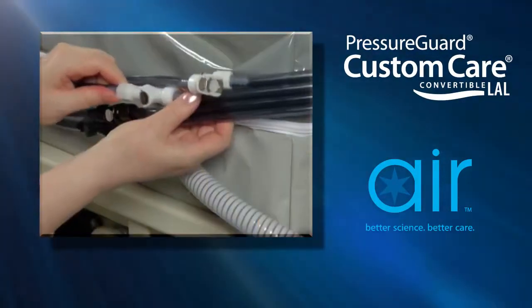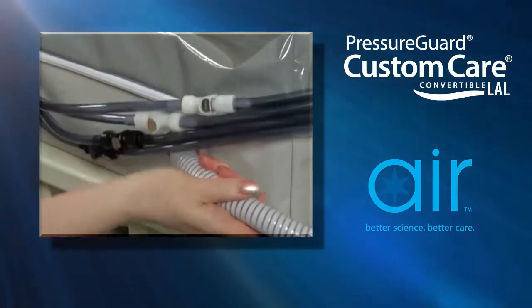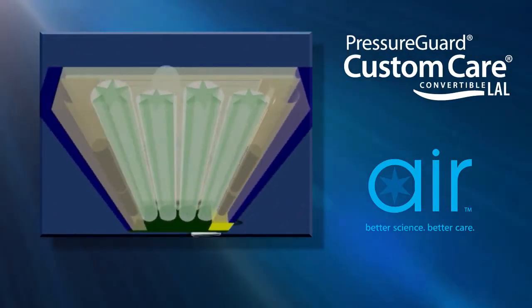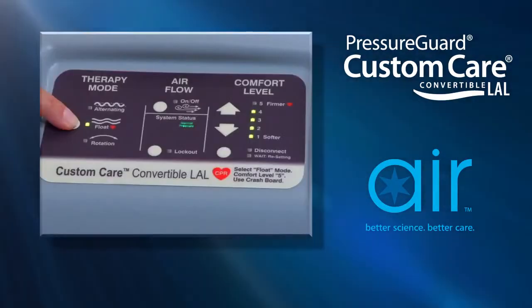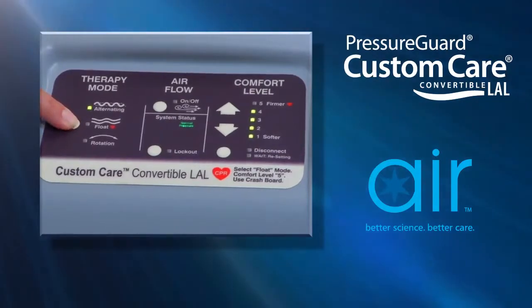The Custom Care Convertible LAL becomes a powered surface with the easy addition of a control unit, providing a choice of air therapies — alternating pressure or lateral rotation therapy — a feature that can save significantly on the need for costly rentals.